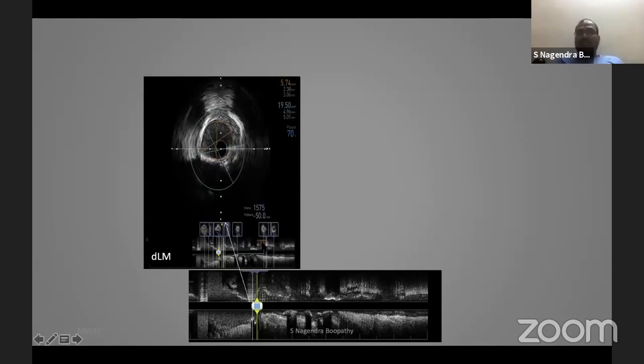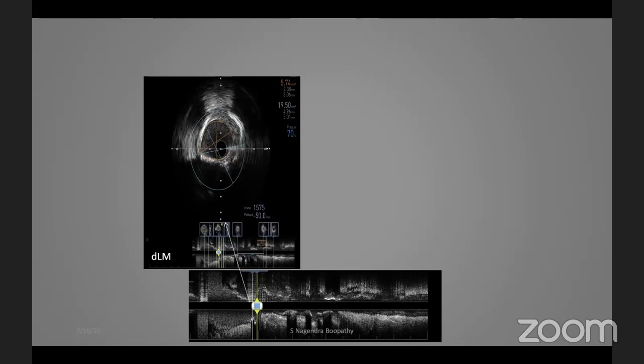So there is calcium, and the arc of calcium is almost 180 degrees on the inferior side, and here something around another 60 degrees and another 60 degrees here. So the entire arc of calcium is almost 300 degrees, and the patient has a heavy plaque burden. So the question is, when the calcium is going to be more than a 180 degree segment, what is the best plaque modification strategy? Is it AngioSculpt, cutting balloon, or rotablation? What do you do?